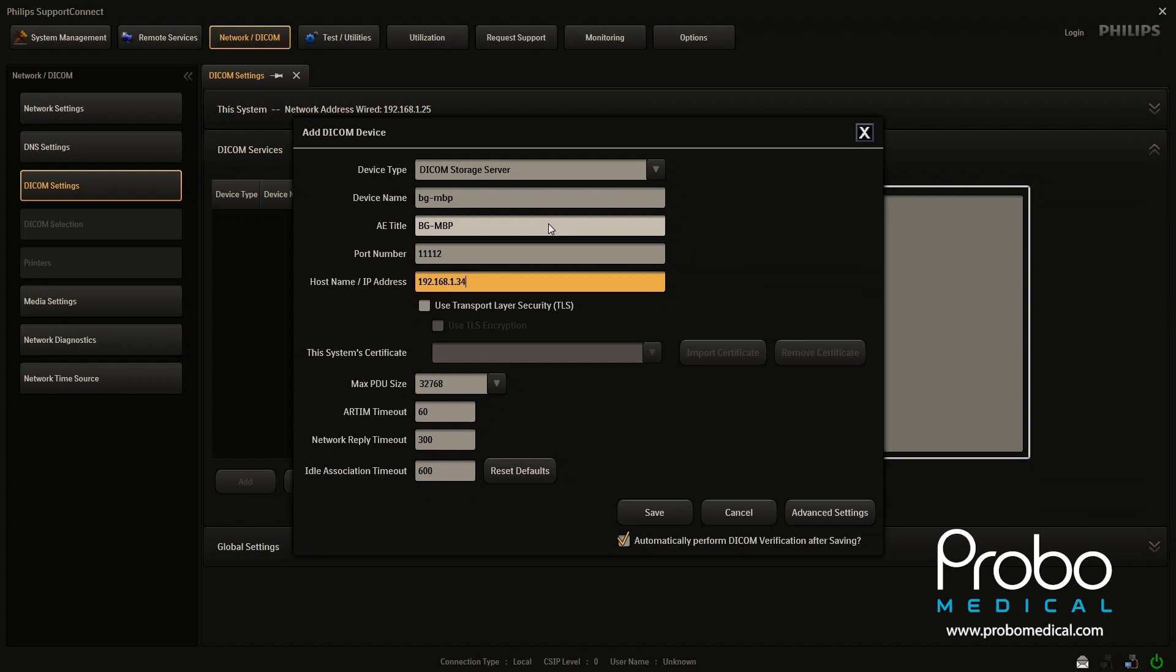And you're going to get that from the PACs company. You're going to get it from the IT group. Somebody like that.